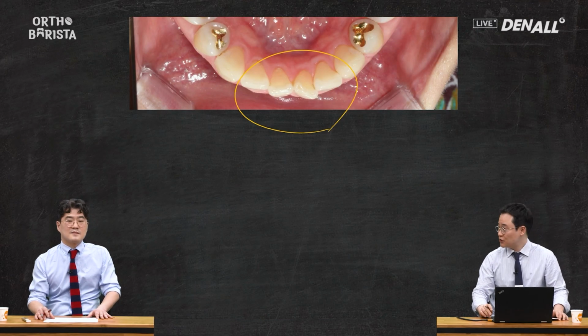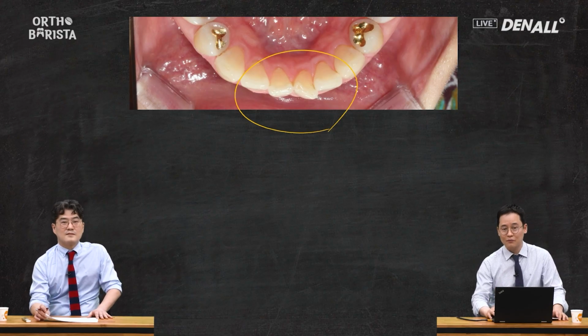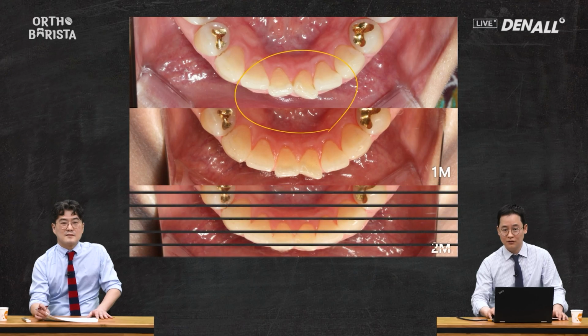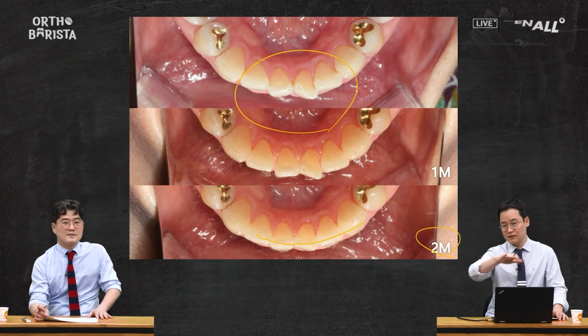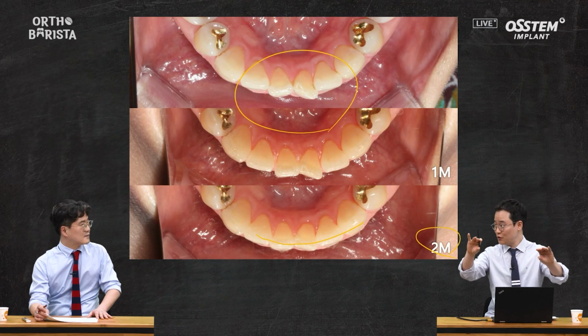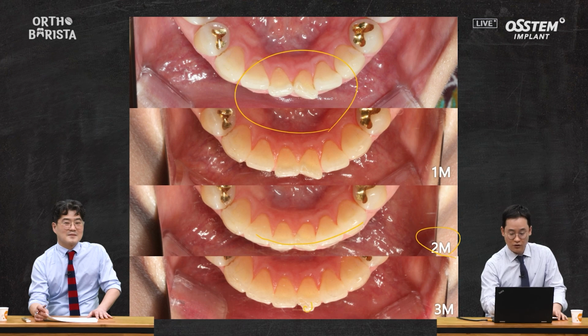However, challenges remain, particularly with mandibular teeth, which are smaller and less likely to rotate effectively. For instance, in this case, the setup process is completed within 2 months. While the aligner design intended to achieve proper alignment, the teeth have yet to respond as expected. In such cases, as mentioned earlier, attaching an attachment to the tooth helped achieve alignment.